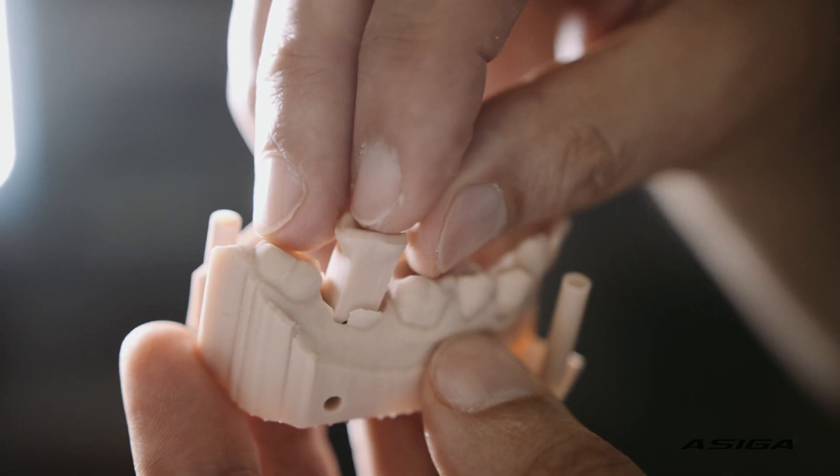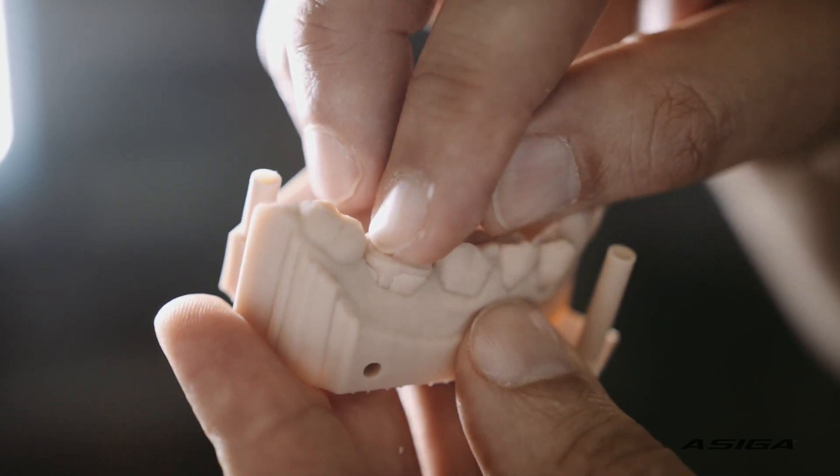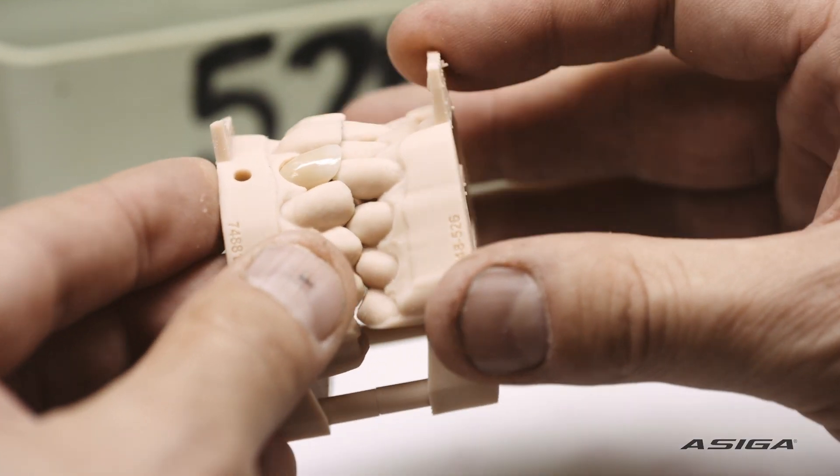The fit of the die into the model needs to be perfect. No movement — we're talking microns now, or thousandths of a millimetre.